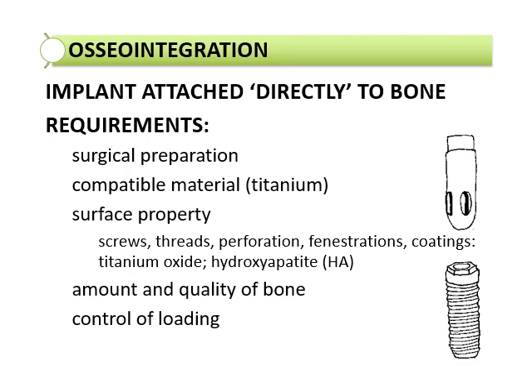And when it talks about the amount and the quality of bone, that is that bone height in the mandible, like I discussed in that picture with the transosteal implant, where it seemed like the mandible was very low in height. You want to have a certain amount of bone height, quality, and quantity to make a difference for the fixture to be successful.